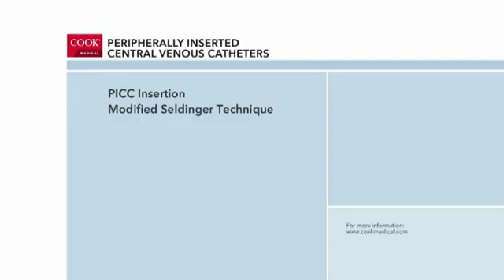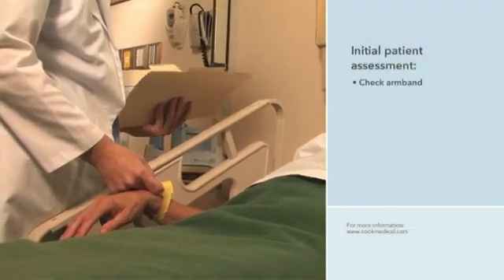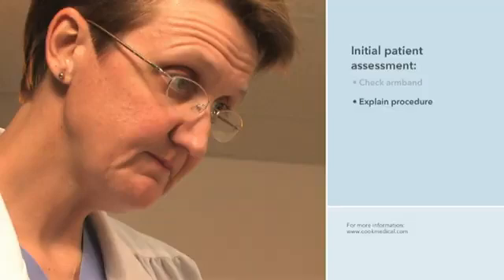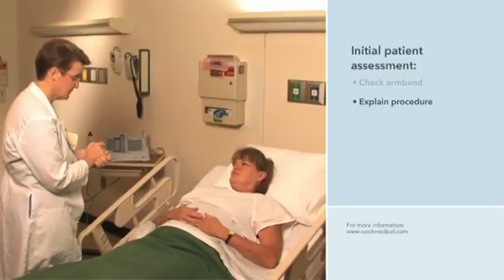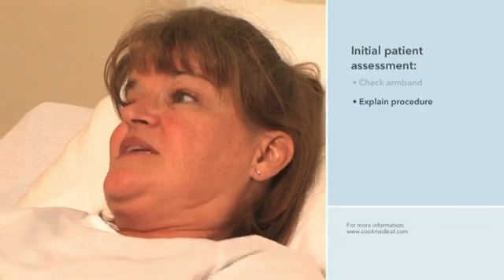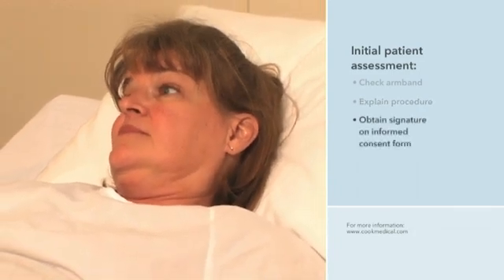The PICC placement procedure begins with an initial assessment of the patient. During this assessment, the clinician checks the patient's armband to verify identity. The clinician explains to the patient and caregivers, if present, the steps of the PICC placement procedure. She will also discuss the patient's responsibilities during and after the procedure and potential complications. She answers any questions before requesting that an informed consent form be signed.